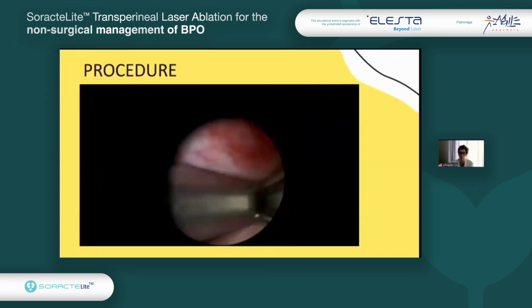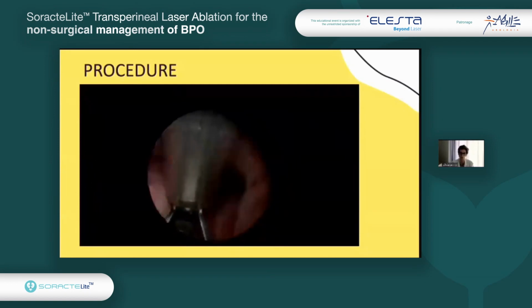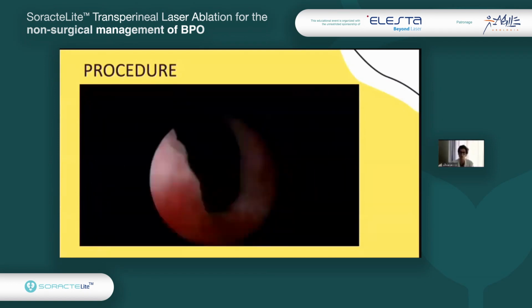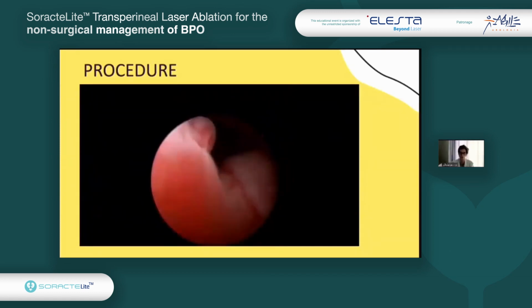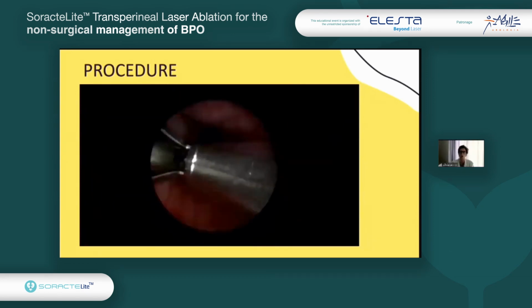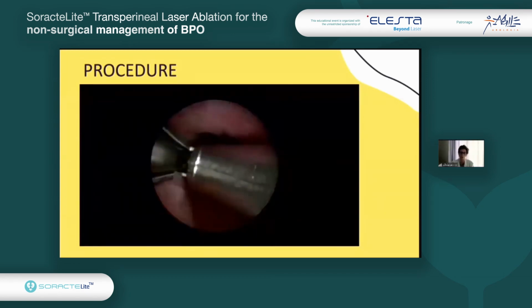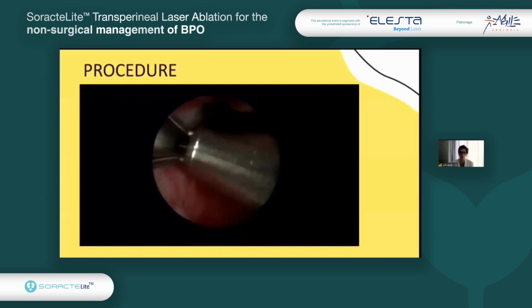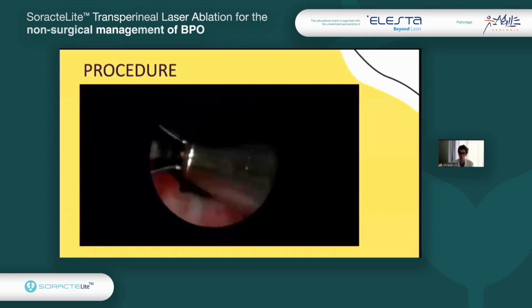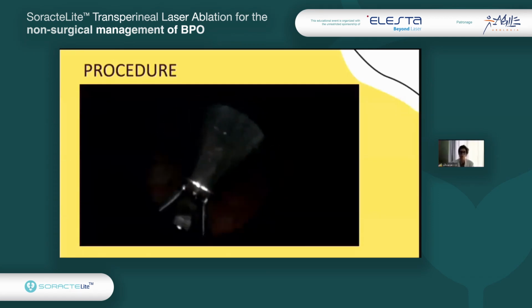The patient is in a supine position, a gynecological one. You can, of course, perform in general anesthesia, but nowadays we are performing in local anesthesia so that the patient can go home after a few hours of the procedure. And this is a big advantage also speaking into this particular era where COVID has conditioned our life and our occupation of the theater.